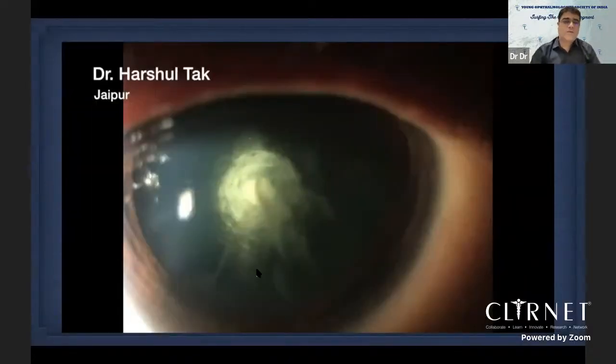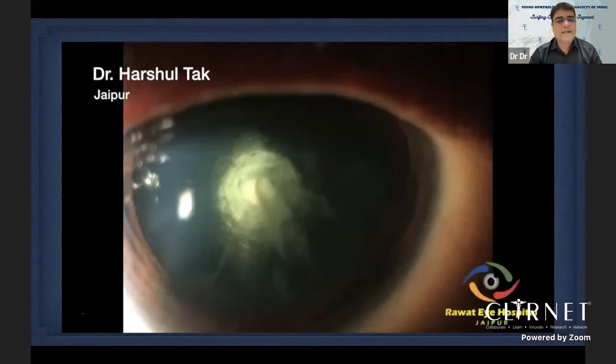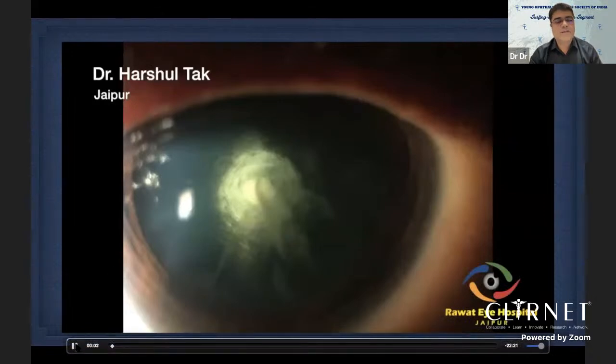So now let's go through the video and understand the basic principles which we have to follow. The occurrence of PCR is not an issue. The problem lies in improper handling of the posterior capsule rupture when it happens.